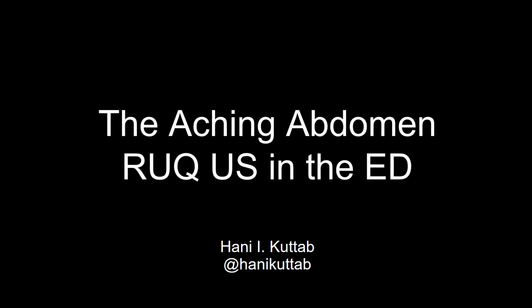I love gallbladders, and I find that doing a bedside ultrasound really helps to speed me up in the workup of patients that present with abdominal pain. So I'm excited to share some of the tips and tricks that I've learned along the way.